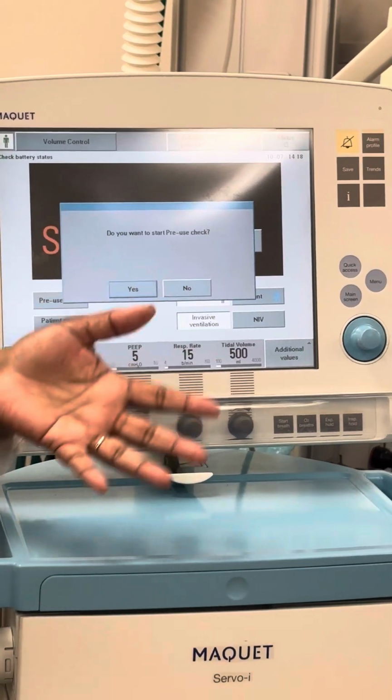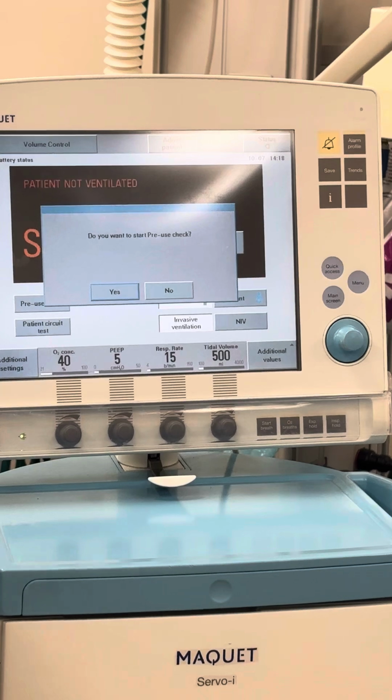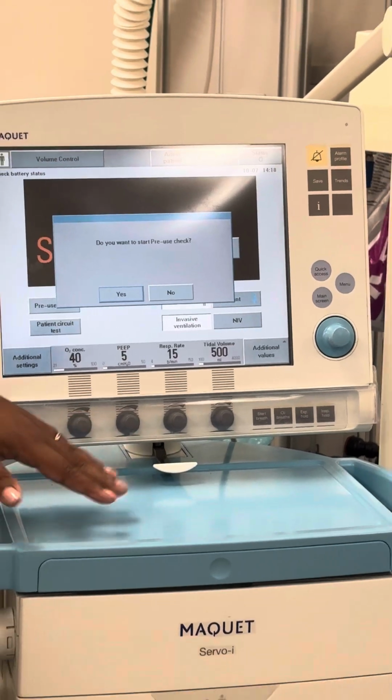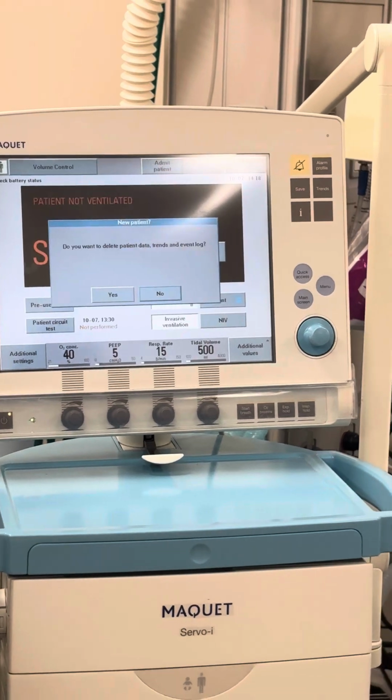Of course, in the lab you would do your system operations check. Any leaks, any ventilator operations or any circuit operations, you're gonna do a system check, but not right now. We're not doing that today. But yes, you would, but we're gonna say no today. This guy asks you another question.